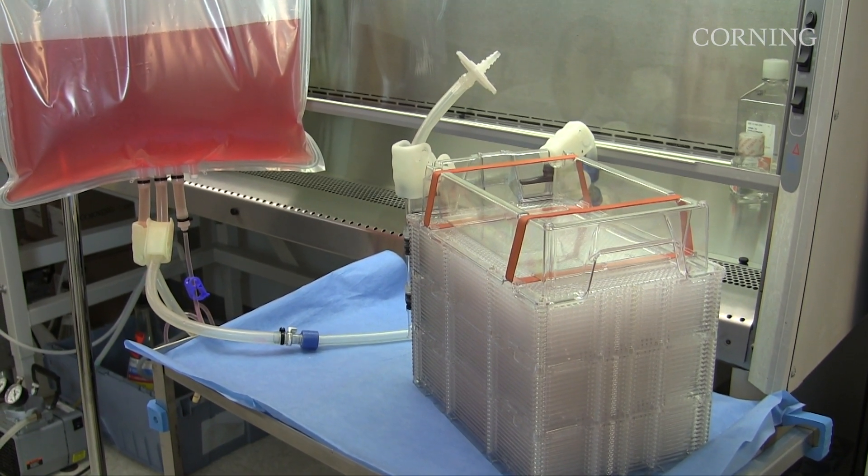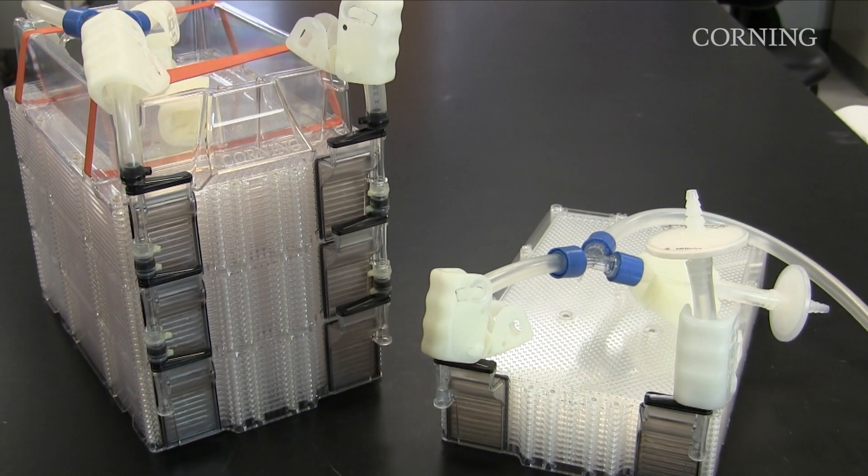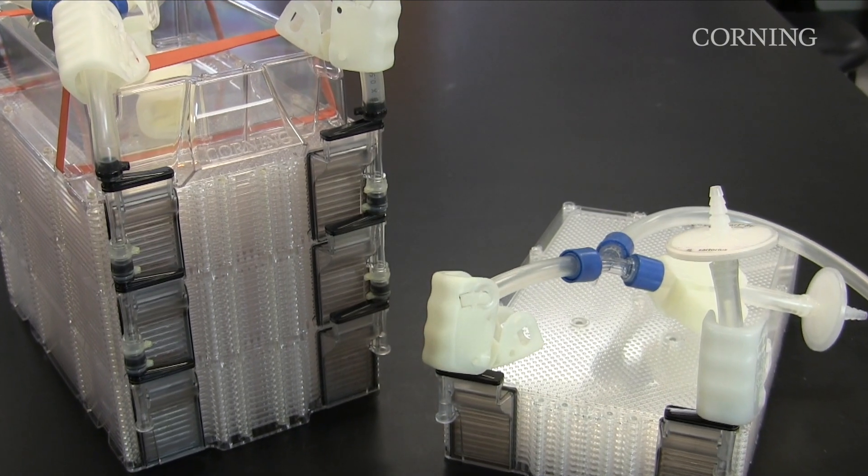This procedure should not be used for vessels that are connected together. Please contact a Corning account manager or a bioprocess specialist when working with connected vessels. Before we demonstrate the procedure, let's review the components of the Hyperstack vessel.